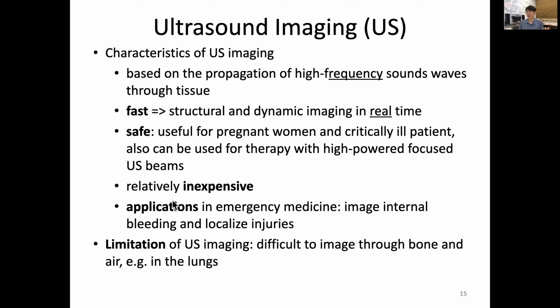And because of this, there are many applications, and ultrasound is one of the most widely adopted medical imaging technologies inside the clinic. For example, in emergency medicine, for imaging internal bleeding and localized injuries inside the body, we probably use ultrasound.